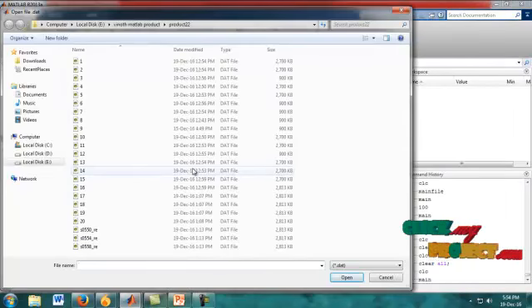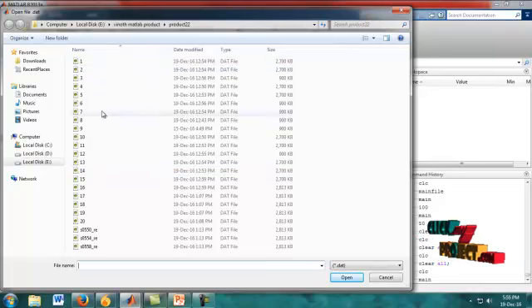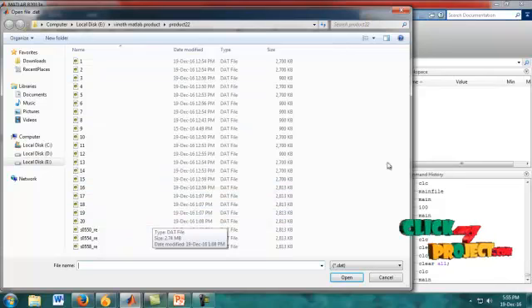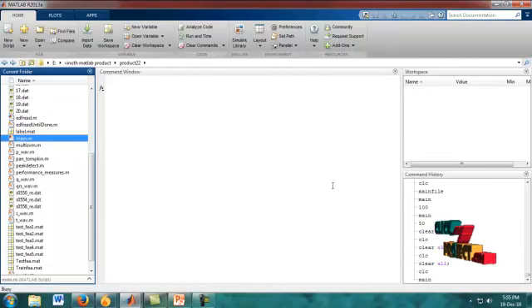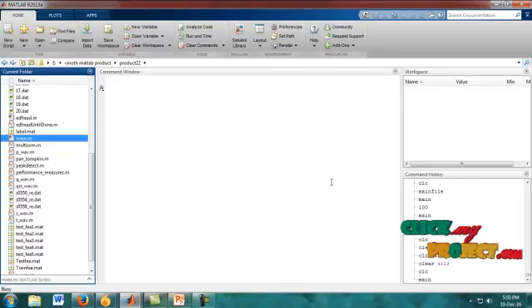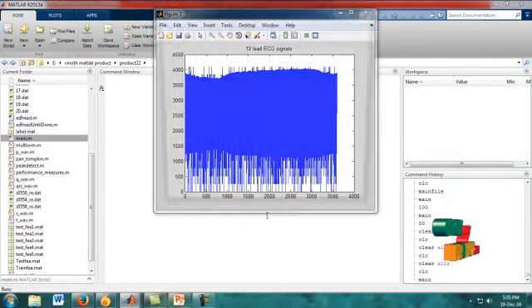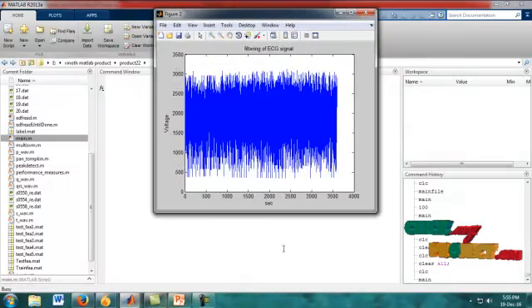We run the main.m file. After running our source code file, we choose the signal. There are many types of signals available and we choose any one of them. The process will then proceed.